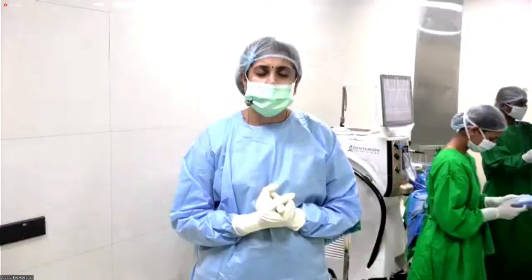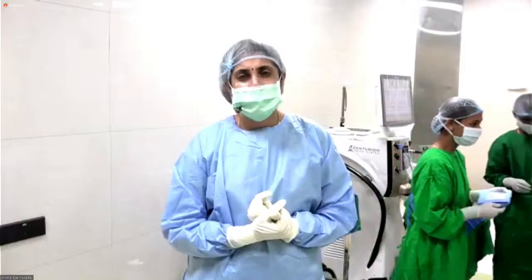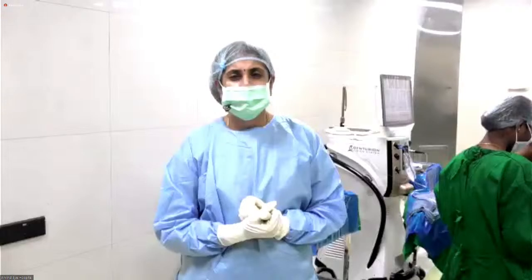Because what I feel is that these days we have very good lenses which can provide 6/6, N6, and even good intermediate vision. But I guess the time has come that we have to think about the aberration profiles. Absolutely. Which is the biggest concern today, why we're not able to implant more of the other multifocal lenses. So that's where maybe these lenses would help a little more. And many times in diabetics, we are a bit hesitant in implanting any of these lenses. We prefer, say, monofocal. But if the aberration profile of these lenses improves, then for somebody who is not having frank diabetic retinopathy, say 60, 65 years of age, with good glycemic control, one may consider putting these lenses in. Correct. Yeah. That's true.